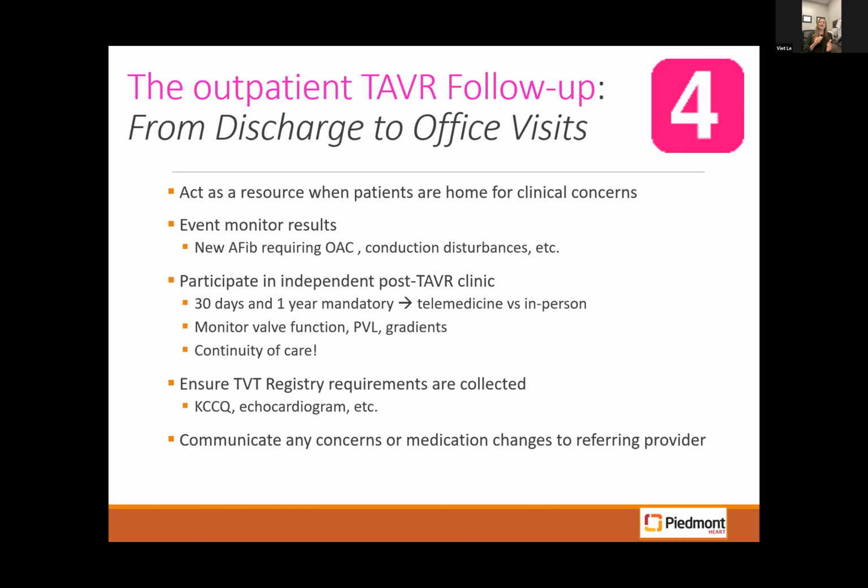APPs can participate in independent TAVR follow-up clinic, 30 days and 1 year as mandated by the TVT registry. Of course, in the era of COVID, that has changed a little bit, in person versus telemedicine, hybrid approaches. But there are very strict data points that should be collected to aid in your program, and more important as time goes on, in public reporting and so on. But APPs, of course, can monitor valve function. They're looking at PVLs, elevated gradients, anything concerning.